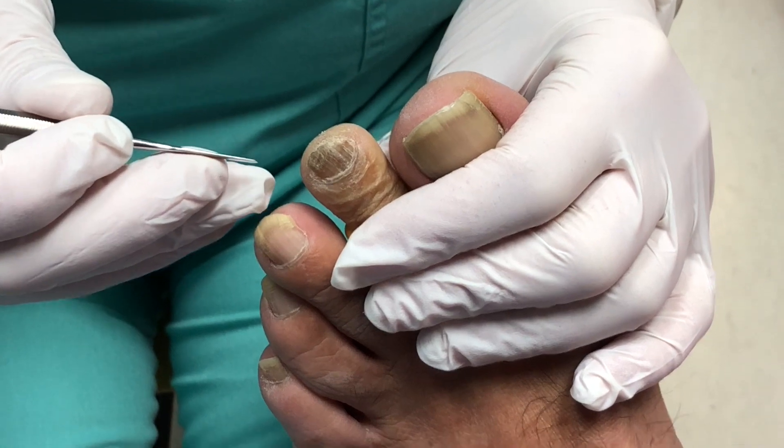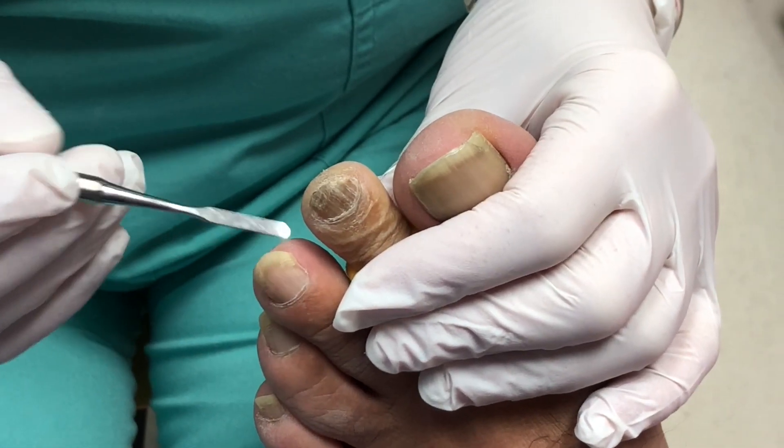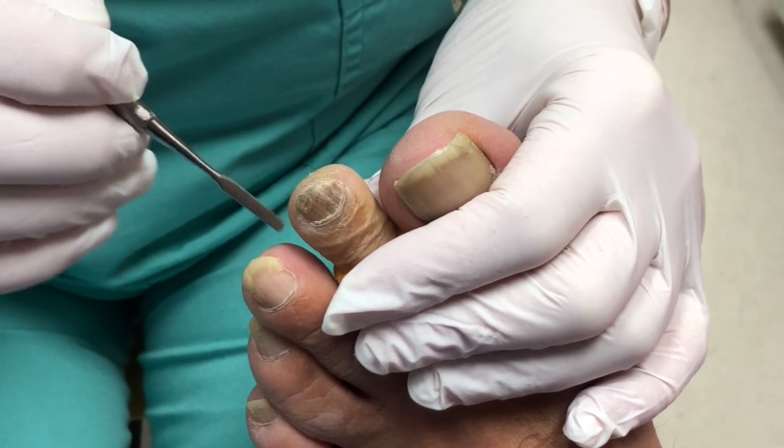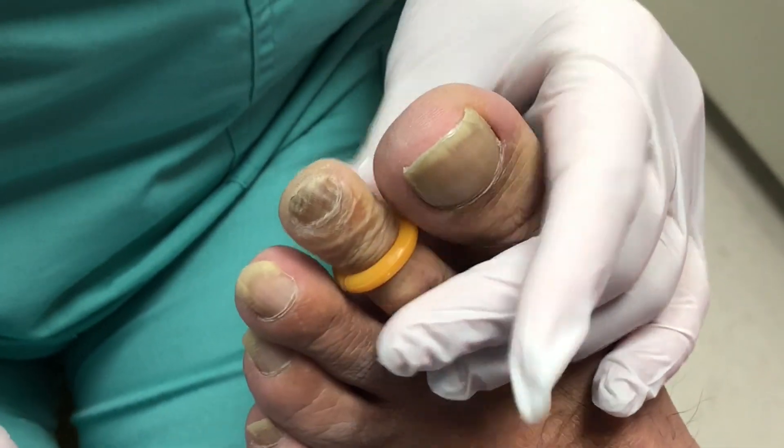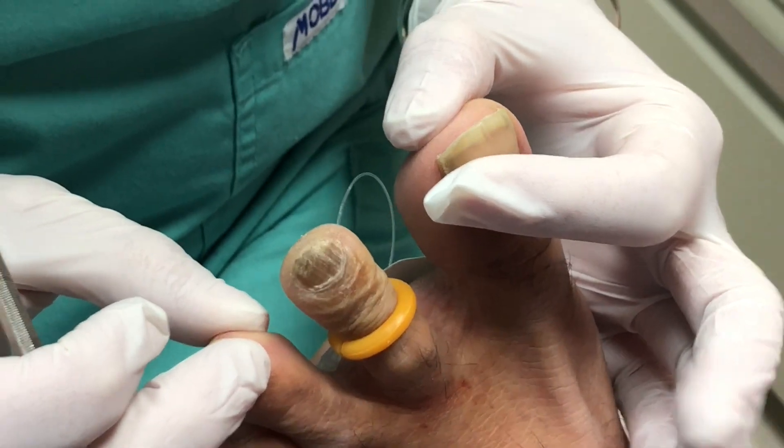Hi, this is Laurie Letty Mackey with Sucuropathy Clinic and I have a friend of mine here that has a horrible toenail that drives him crazy. It's thick, he can't cut it, it causes pressure and pain. So today we're taking it off.